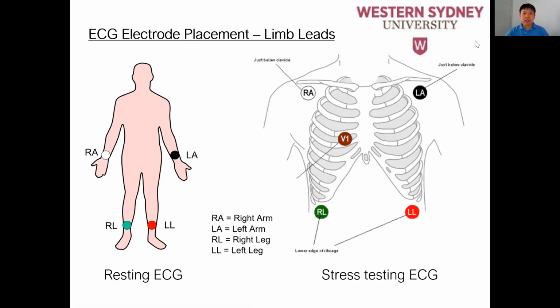So one thing that I saw from Dr. Eshu's talk is she did omit a bit about ECG electrode placement. This is very important in order to ensure you get an accurate ECG interpretation. This might be revision for some of you who might have already had some ECG exposure experience. So ECG can be split into two different leads. So you have limb leads, and then you have the chest or precordial leads.